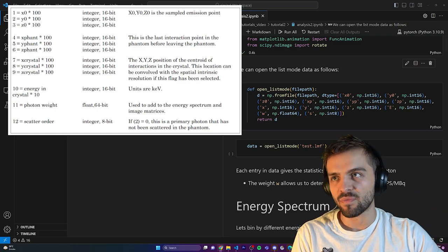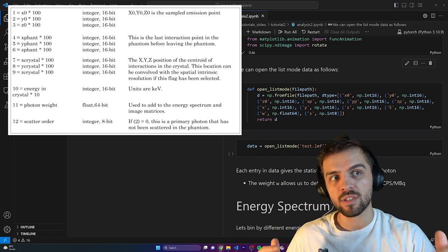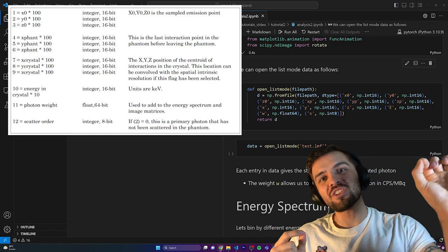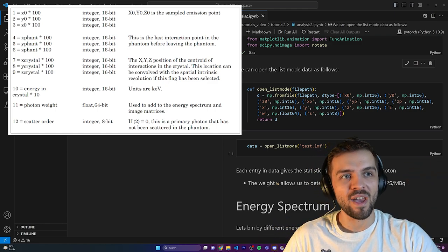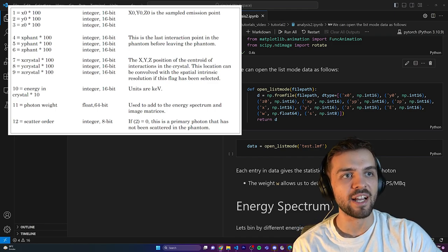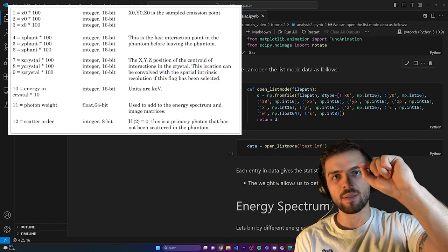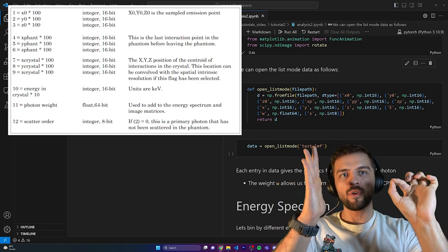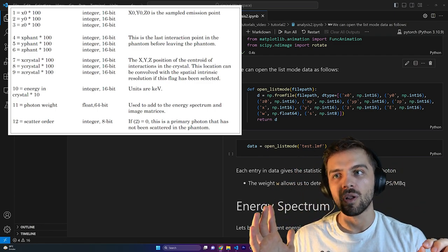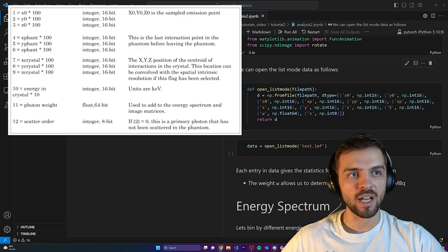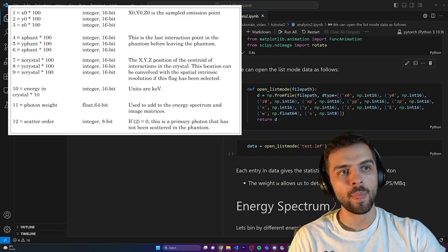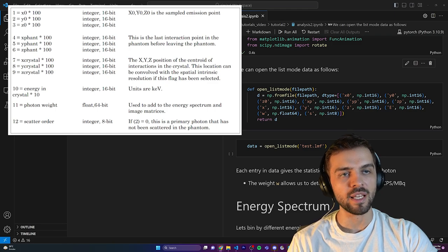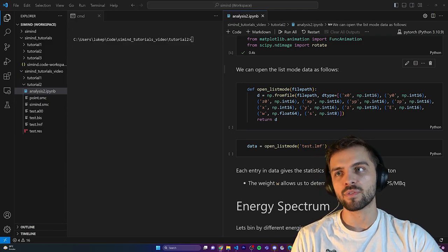Remember that in the last video, all the projection data was stored in those units. The photon weight gives that unit to each individual photon, so it's going to be very, very small. There's also the scatter order — the number of times the photon scattered in the phantom before reaching the detector. The beautiful thing about the scatter order is that if it equals zero, we can differentiate it as being a primary photon, not a scattered photon.